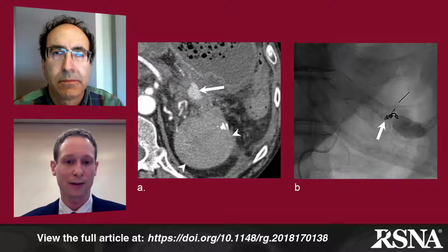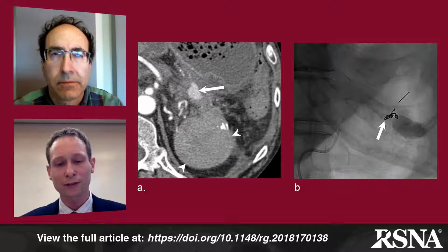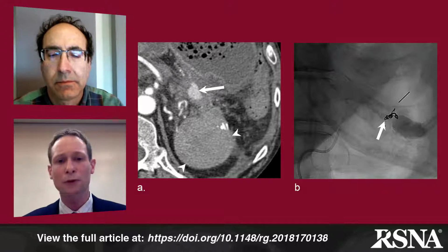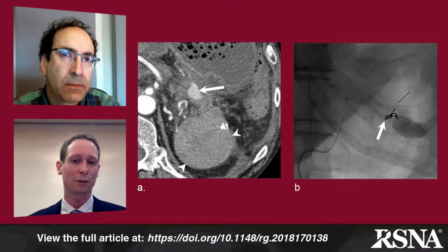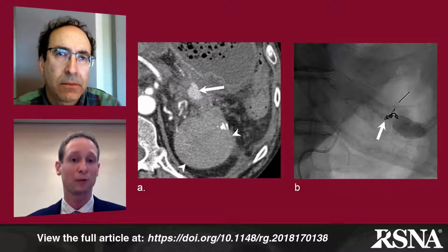Multi-phase CT enterography, on the other hand, is really a protocol designed for patients who are stable and who are outpatients. They've also typically had negative upper and lower endoscopies, so we're very suspicious that they have a small bowel lesion. And for enterography, we're not so much looking for active extravasation, but we're trying to optimize our evaluation of the small bowel wall and look for pathology that exists.